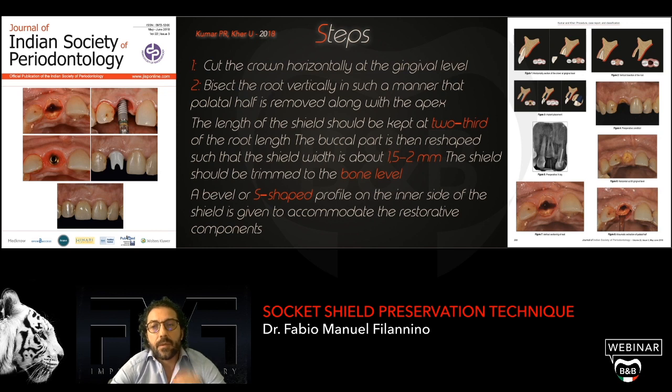And this is very important to me. From my experience, the first important thing is to avoid the mistake of leaving the apex inside of the socket. So this is the most important thing.